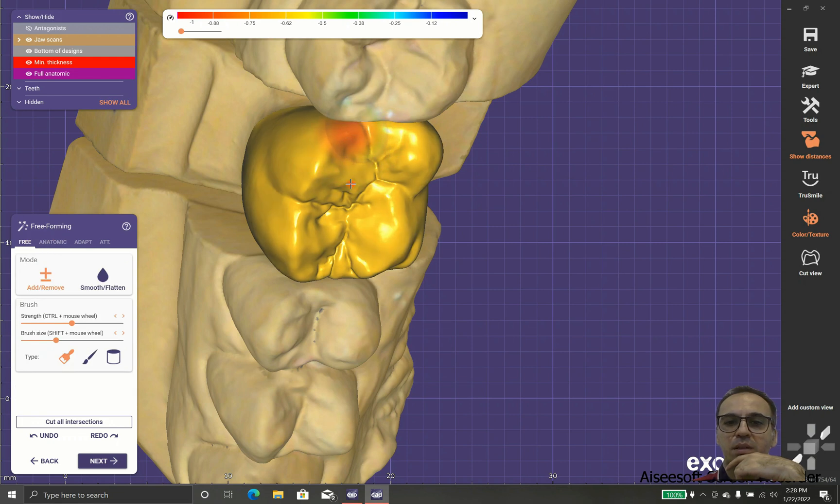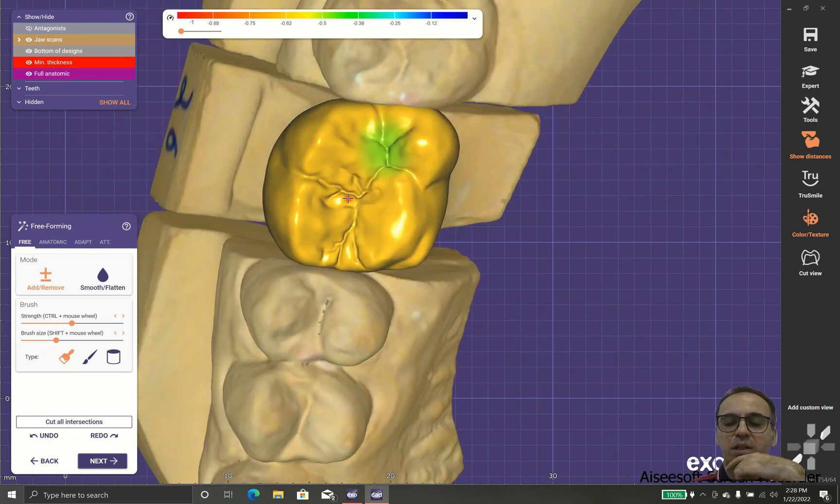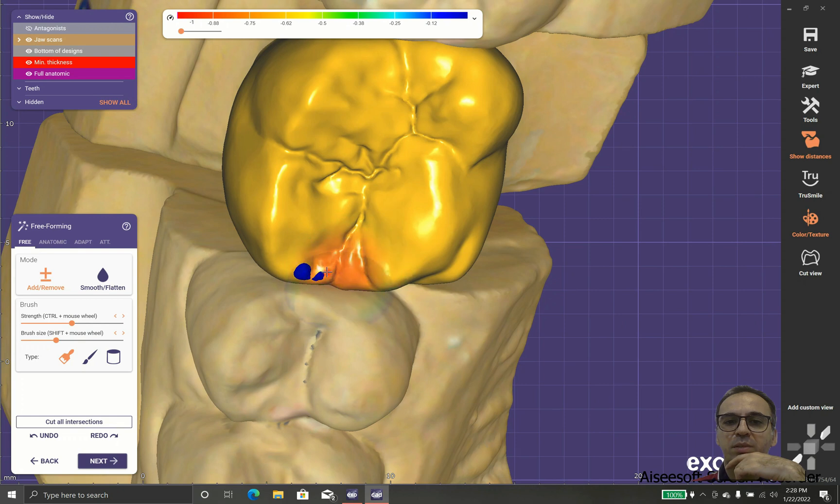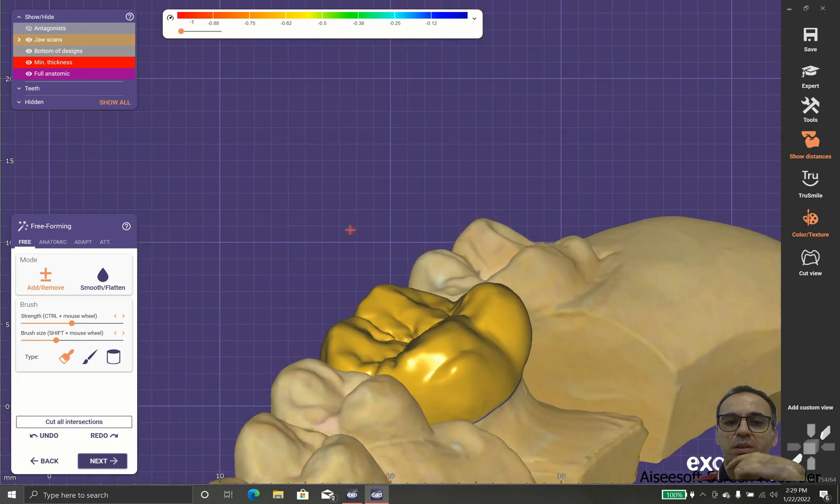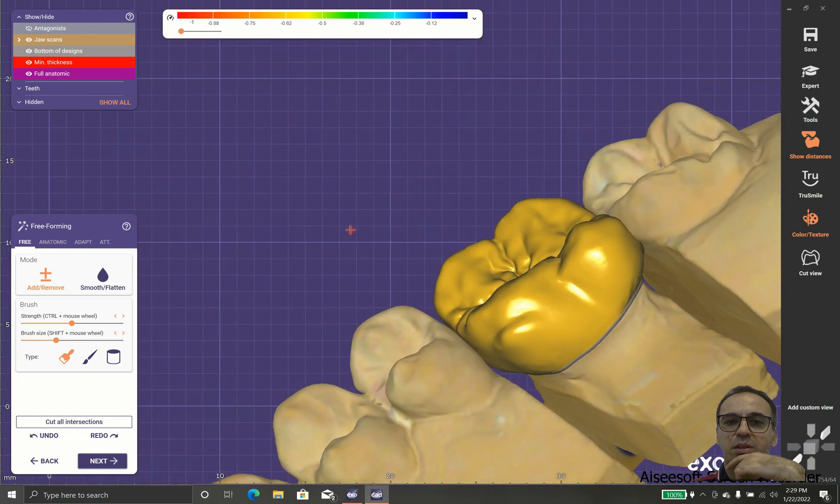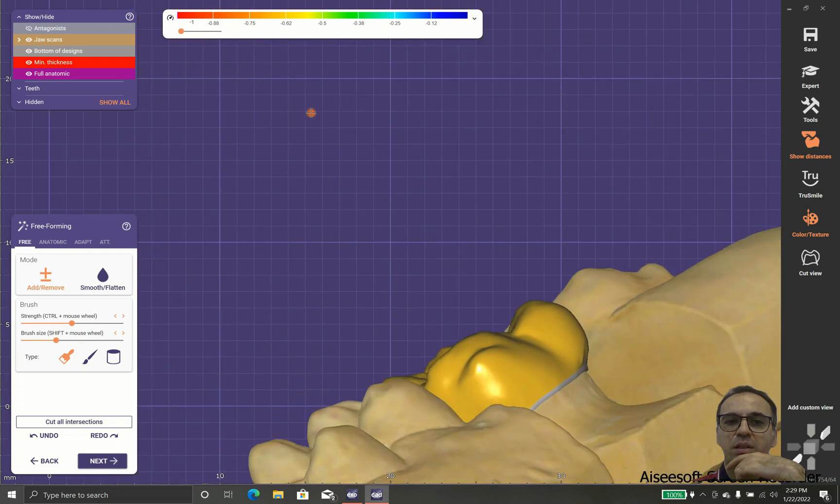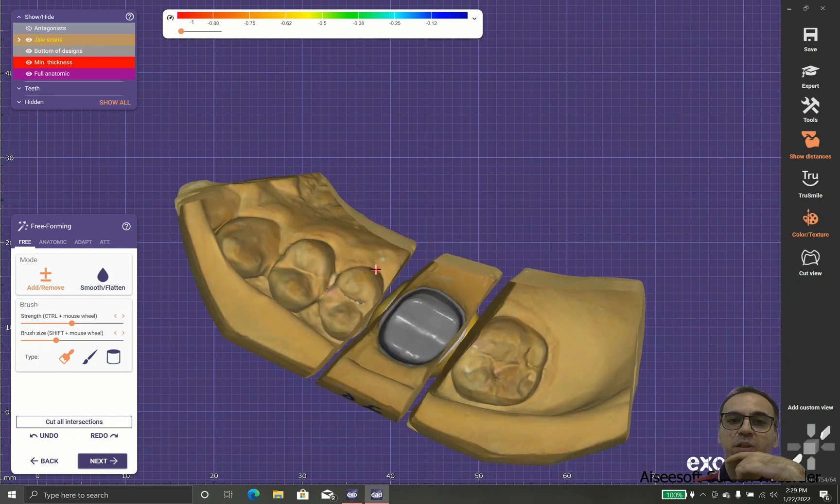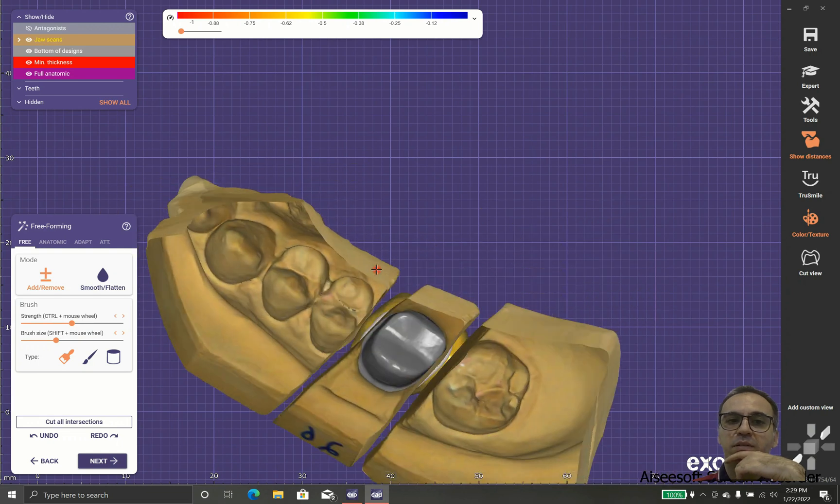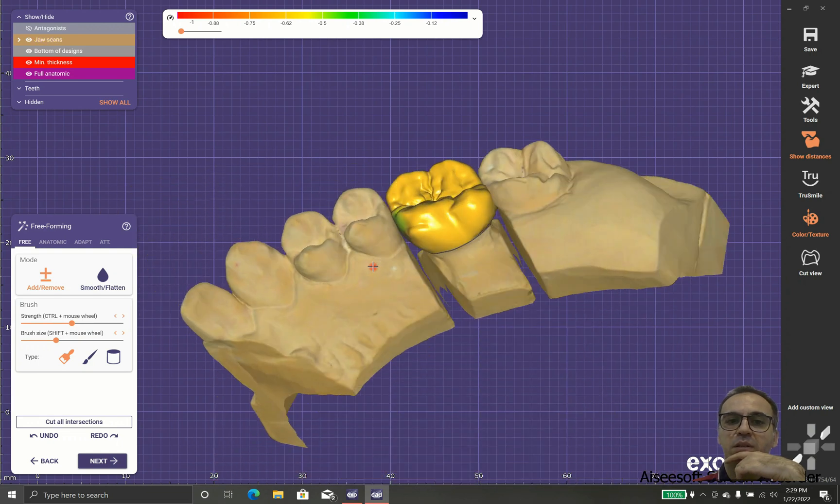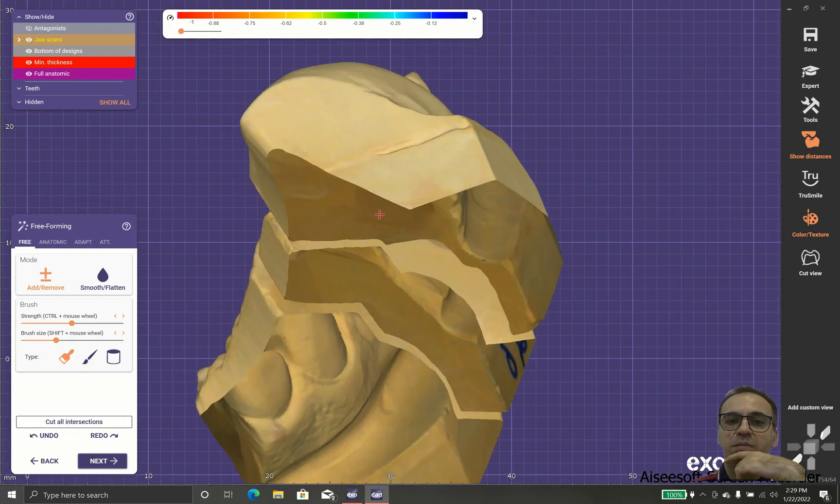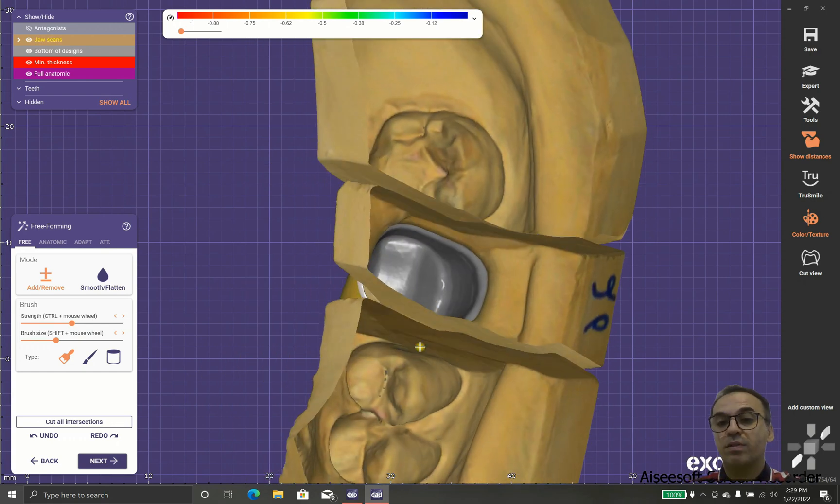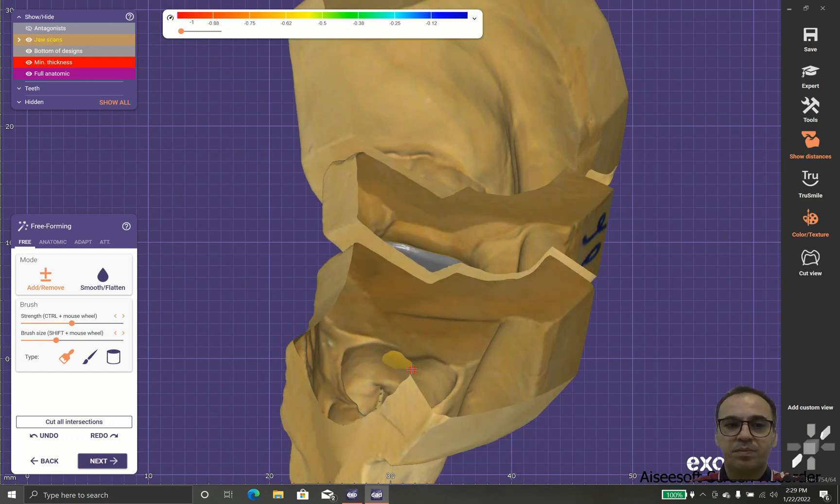As you can see, I play with cusp tips to put them in the proper position. I can add them with the wax knife or remove them in case that I want to have a special form.